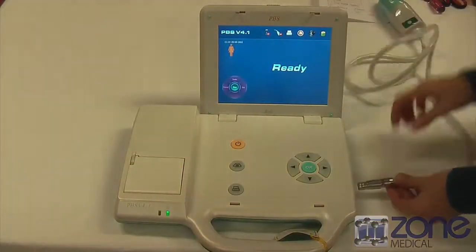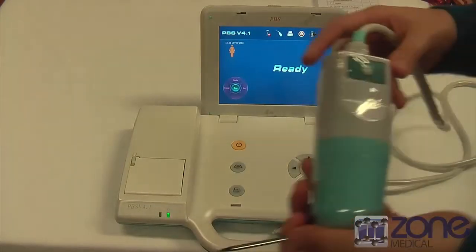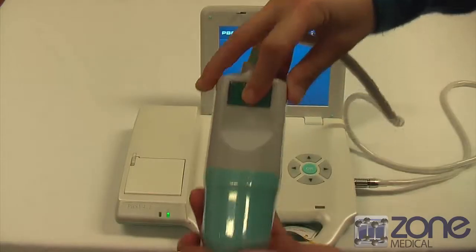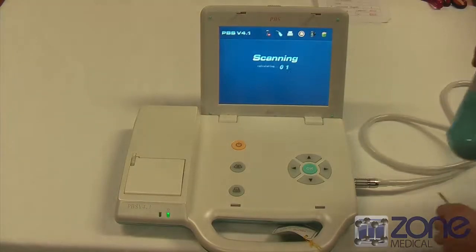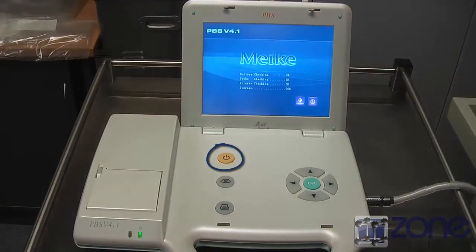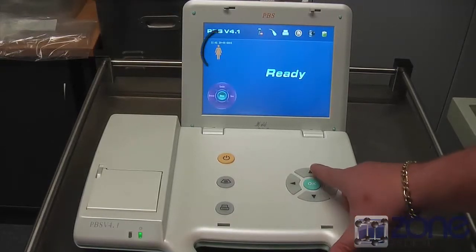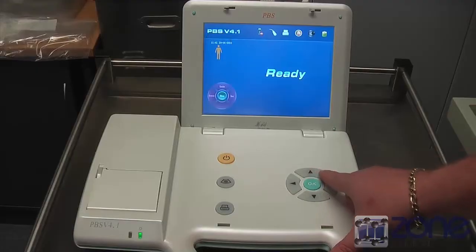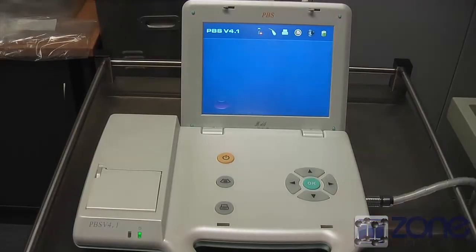You can now attach the probe to your device. The probe also has a button to show you the patient's left and right. As soon as this button is pushed you will feel a vibration and the test automatically starts. To turn the device on you can press the yellow power button. The arrow functions allow you to go to the menu and settings, change the gender of the patient, and you can also change to the pediatric function.